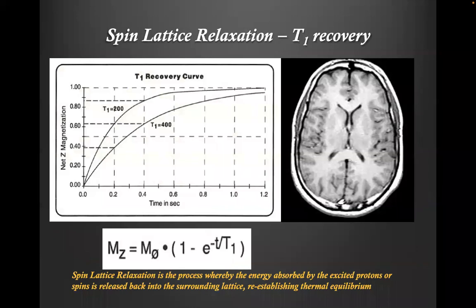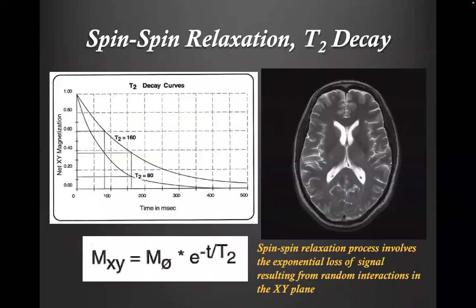And other than proton density, you have some other MR signal properties. One is called T1, which is the spin lattice relaxation. So it's a relaxation time. And you can see different tissues will have slightly different recovery time after they are being excited. And this is called a T1 property. And when you see an image that's T1 weighted, typically white matter appears whiter, gray matter appears darker. So this is the T1 weighting that you are looking for.